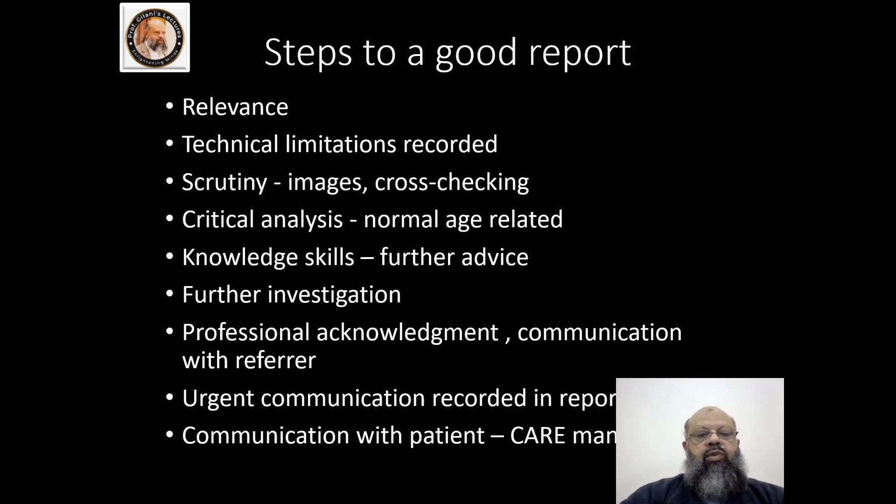conclusion. The main steps for a good report are: first is relevance, that either our examination is relevant to the complaints of the patient or to the requirements of the referring physician. We have to record the technical limitations. For instance, the patient was not able to move his or her hand or arm, any restrictions in the movement or any other limitation. Then is the scrutiny of images and cross-checking with the contralateral side.